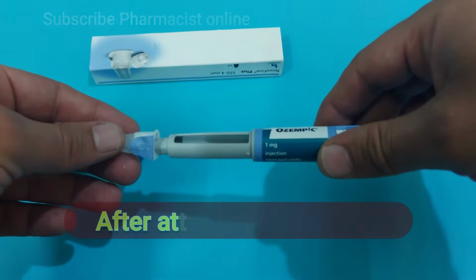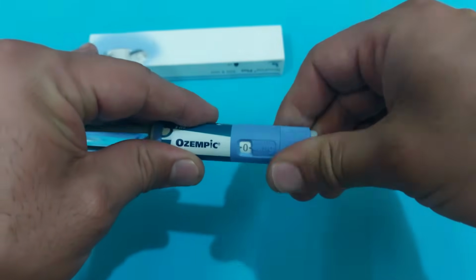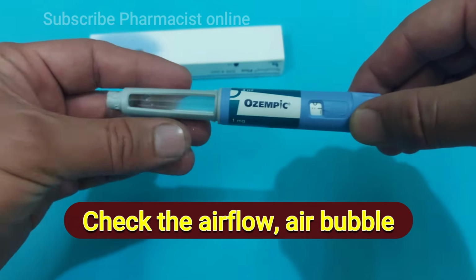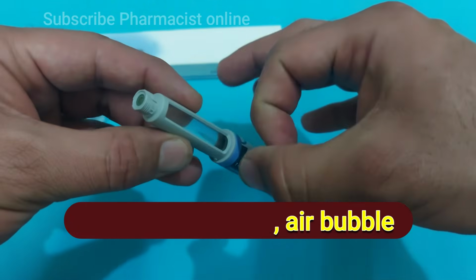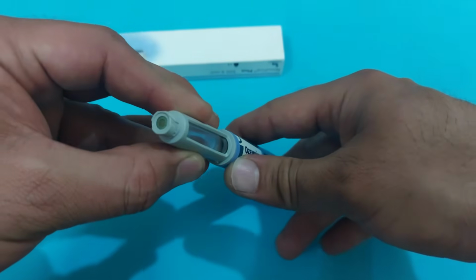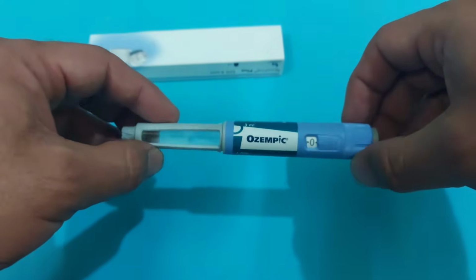You have to attach the needle here, and for the first time, or each time you use the pen, you have to check the airflow. As you can see, there is air in the pen, and you can see it floating here. So attach the needle, push it here like this, and then press the injector button so the drops come out.